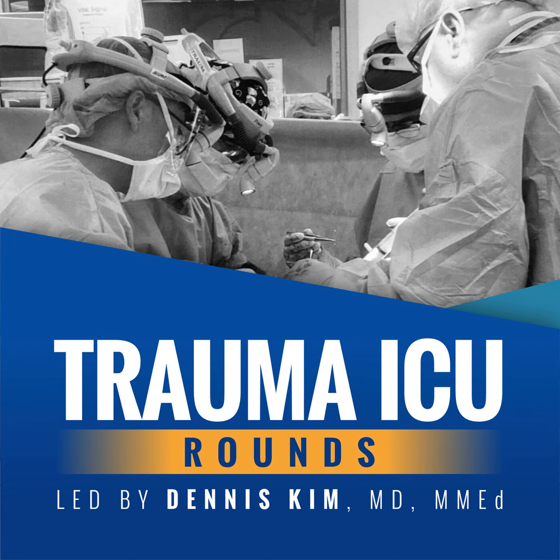If not, what if we have a patient who's tachypneic with a respiratory rate of 30 breaths per minute while on the ventilator? Well, even if the machine rate is set at 12 and the tidal volume at 500 cc's, the patient isn't going to have a set minute ventilation of 6 liters per minute. Rather, they'll receive a minute ventilation of 30 times 500, or 15 liters, which, as you can imagine, has the real potential to result in an acute respiratory alkalosis.